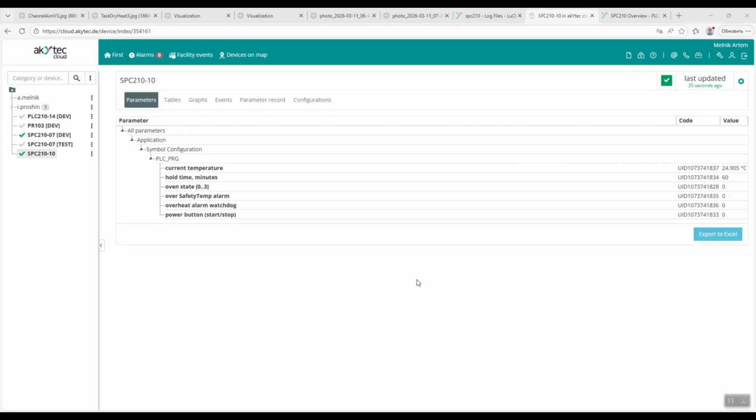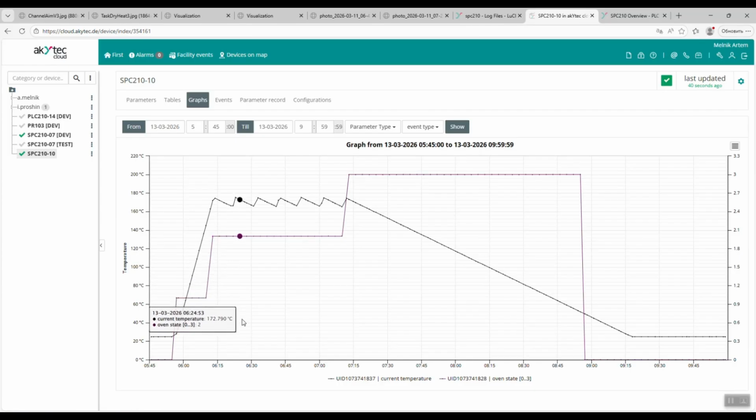Now, let's take a look at the real process chart of the sterilizer in operation. We can see that it displays all three phases we mentioned: heating, holding, during which the chart takes on the characteristic sawtooth shape of two-position control, and cooling. It should be noted that even with a minimum polling period of 60 seconds, which is available on the free akYtec Cloud plan, you can see that the sterilizer operates in normal mode without any deviations in its operation.